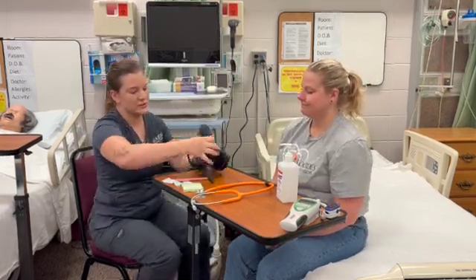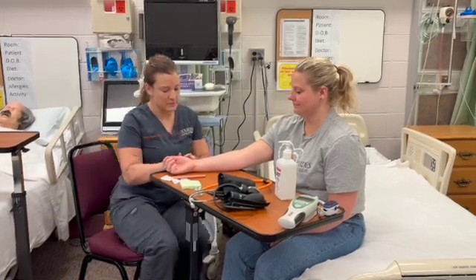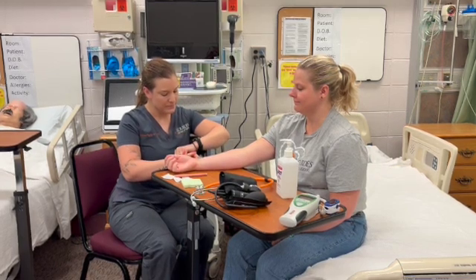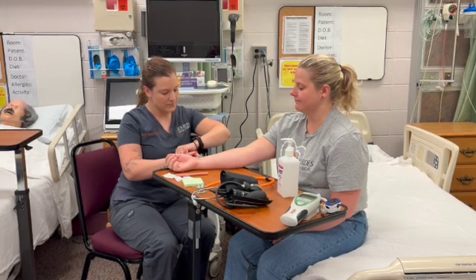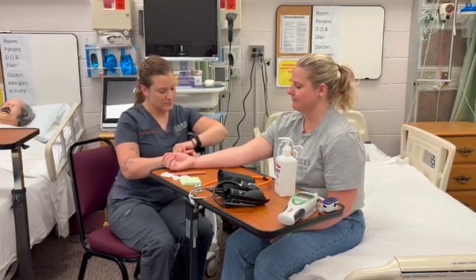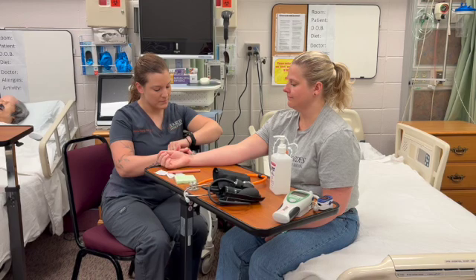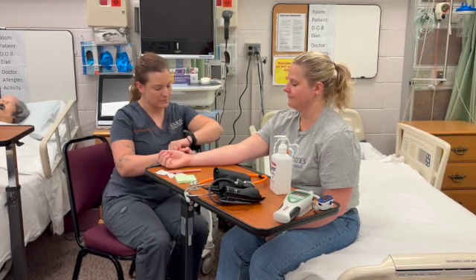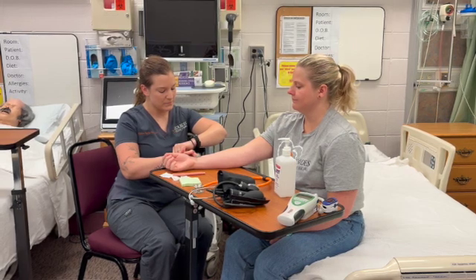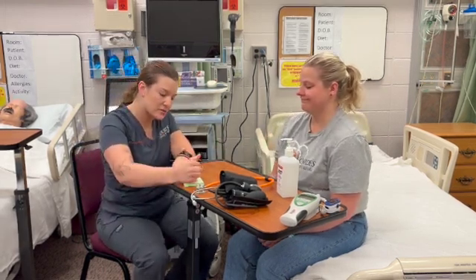So next I'm just going to assess your pulse here, so you can put your wrist back up here. I'm just going to feel — sorry, my hands are cold — checking your radial pulse. I got 62 for your pulse, which is within normal range of 60 to 100.